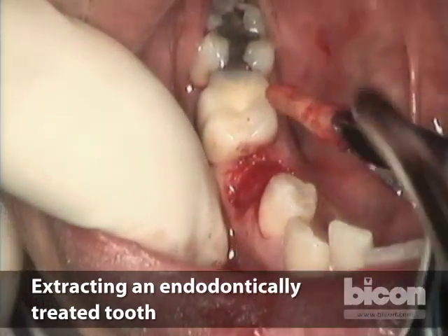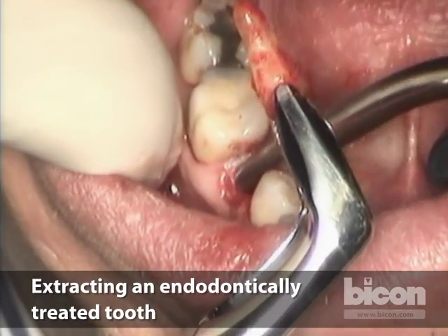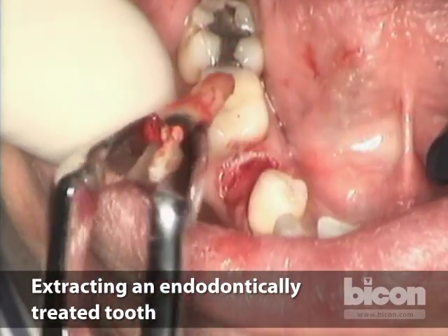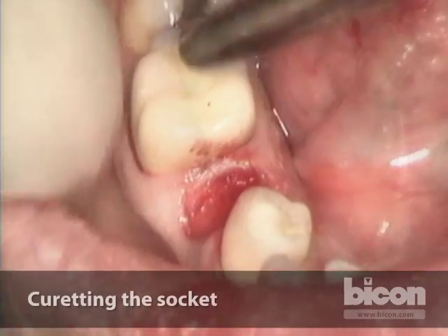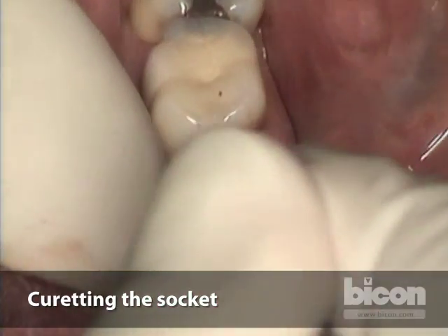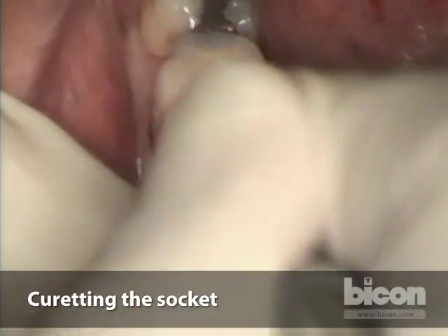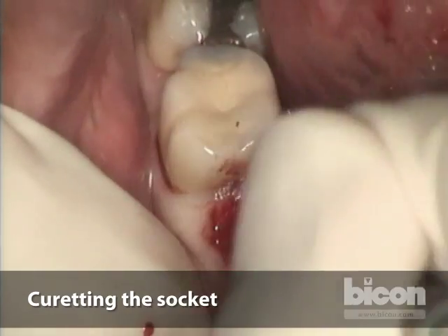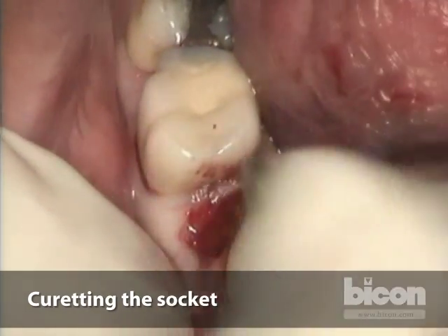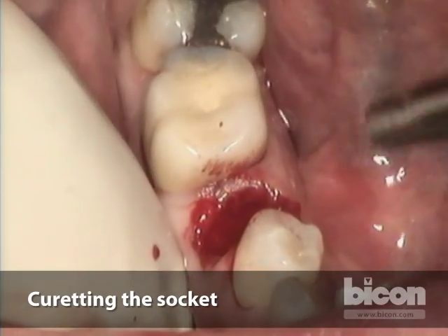Here it is — the tooth has been removed. We look closely to see that there is no bone that came out with the tooth. The next step is very critical: we leave no residual of the periodontal ligament. If we can identify or feel it, we curete it all off of the socket.